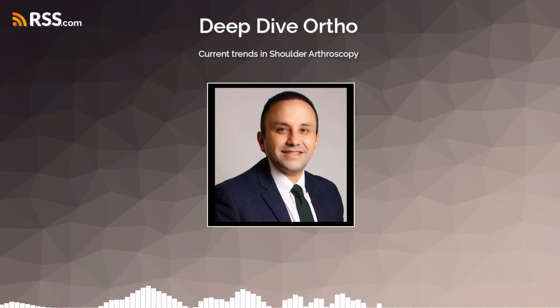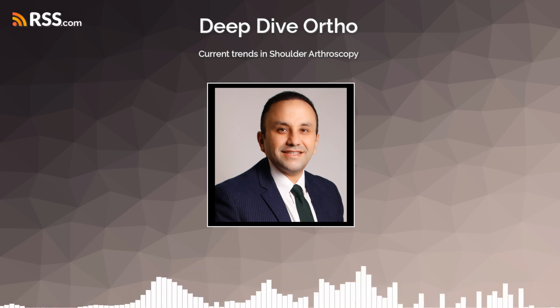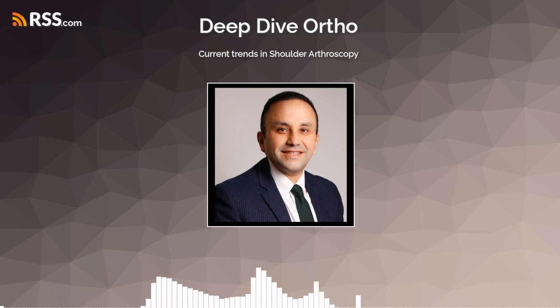Careful diagnosis is important. This often involves pinpointing tenderness directly over the fragment and sometimes injecting a local anesthetic like lidocaine around the suspected non-union site to see if that temporarily relieves the pain. And the treatment. Arthroscopic excision, where the small, separate piece of bone is surgically removed using arthroscopic instruments, is a described alternative to open surgery, either excision or trying to fix it with screws. This minimally invasive approach potentially leads to less post-operative pain and less weakness in the deltoid muscle, which attaches there.